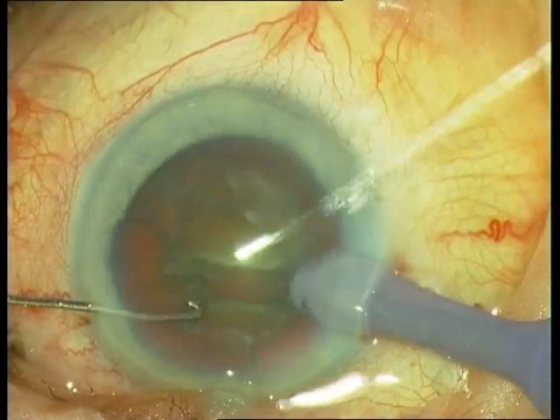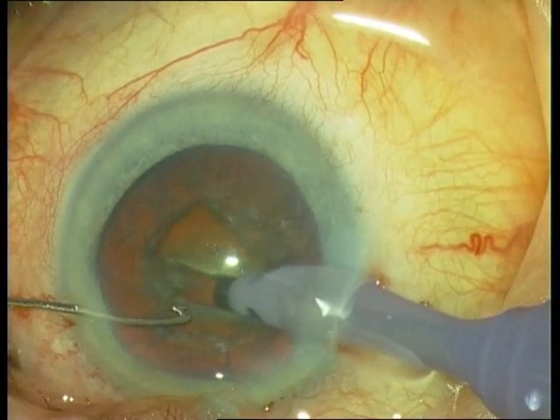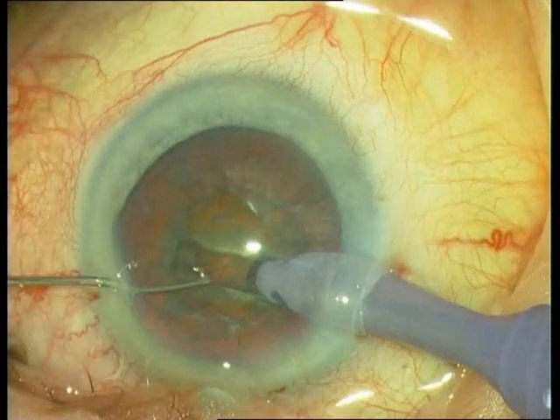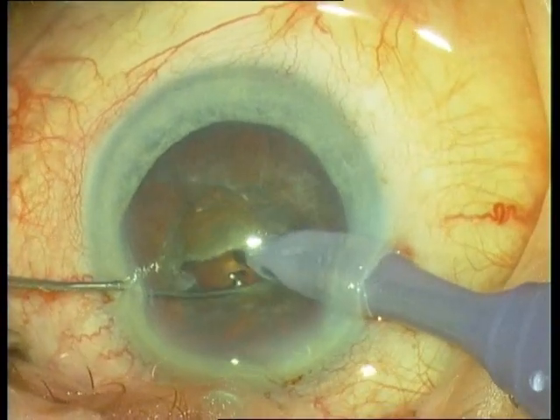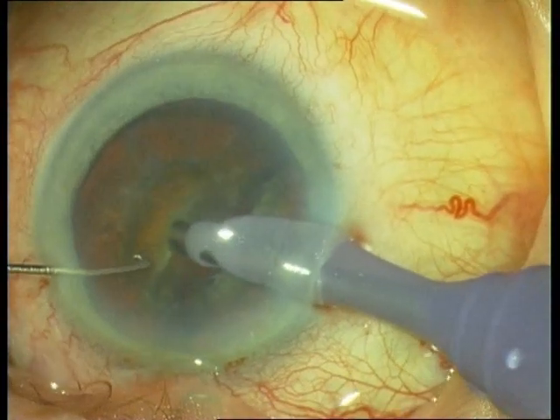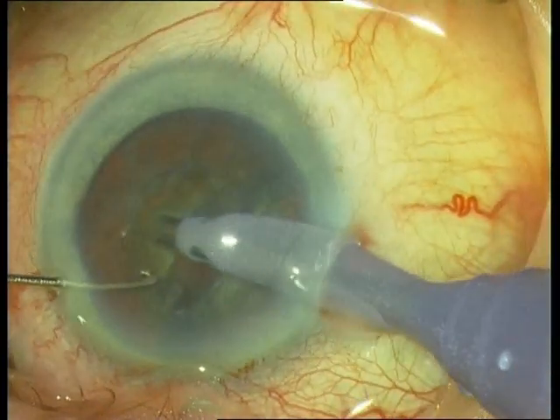This is a hard nucleus, very dense. Focus on the bottom. If you see the red reflex, you're deep enough. This was the cracking, which is easy in this case due to the dense nucleus.